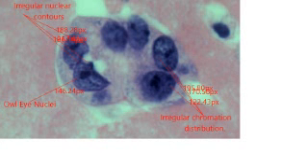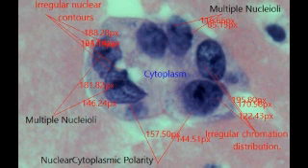I'm presenting a case of an adenocarcinoma of the lower right lobe of the lung in an 81 years old male patient who has a history of smoking and reported shortness of breath. Based on the microscopic description, we were able to confirm the presence of the malignancy. And what I would like to do today is to show you the classic features of an adenocarcinoma and how you can make the diagnosis right on the spot based on morphology and cytology.